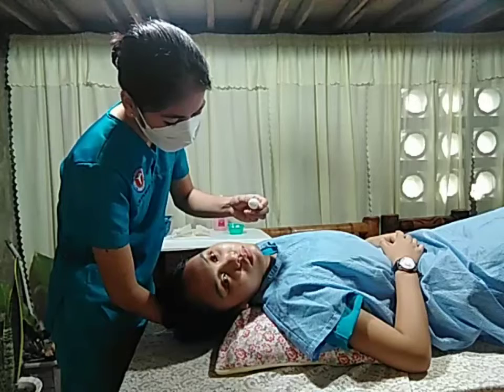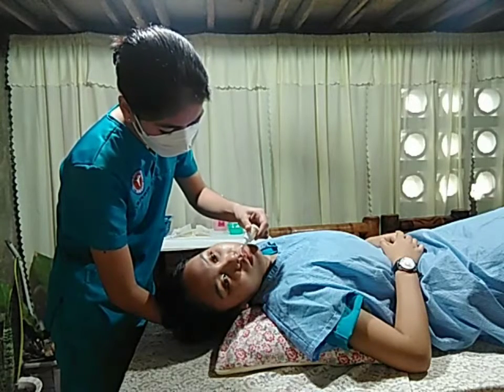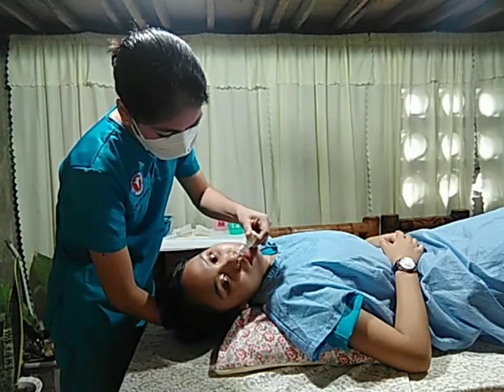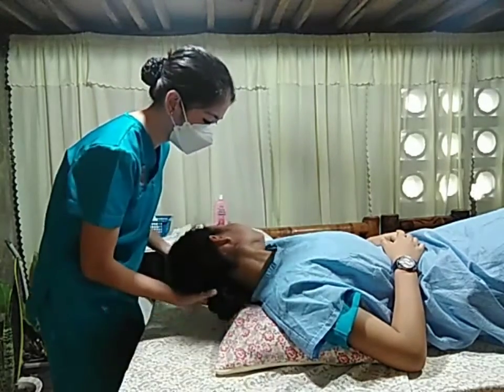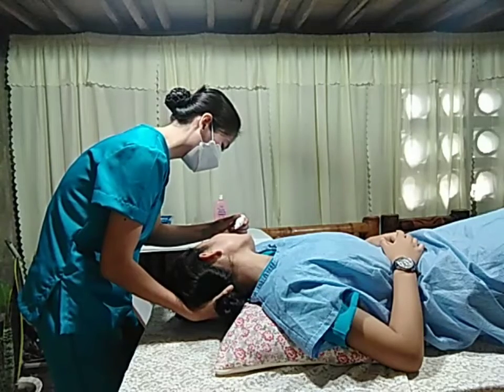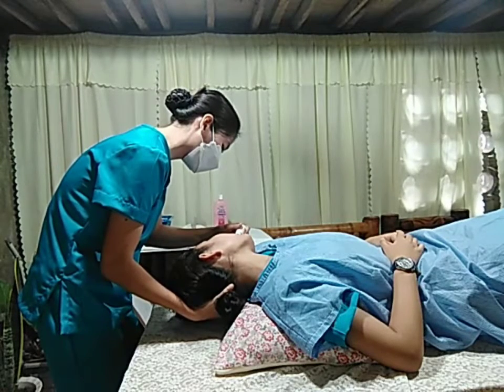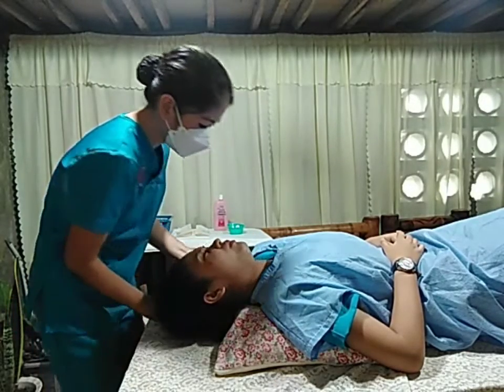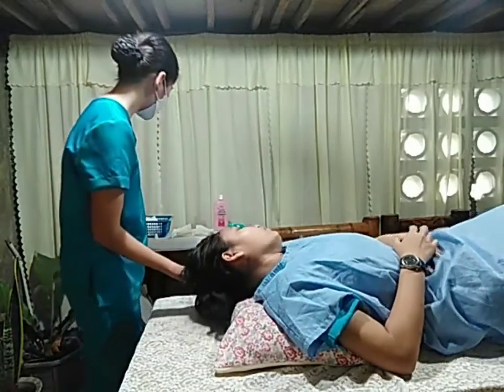Then I'm going to place the dropper 1 centimeter above the nares. 1, 2. Then the other side. 1, 2. Then instruct the client to remain in supine position.